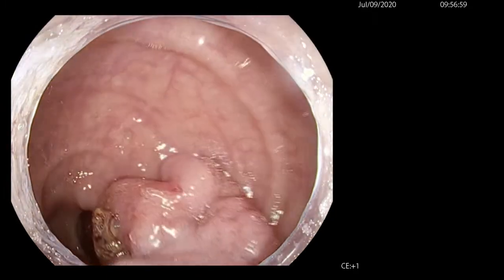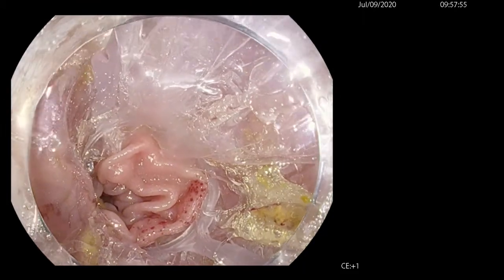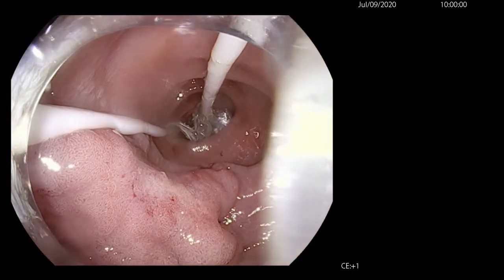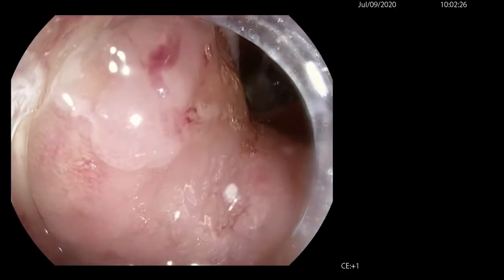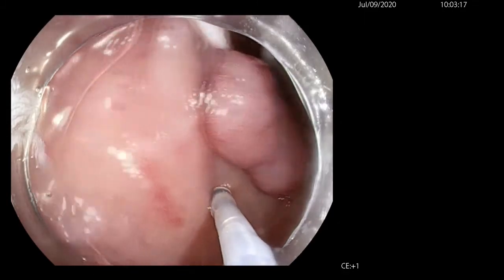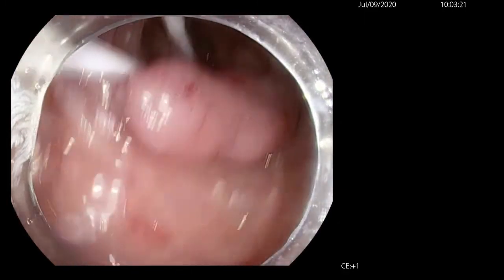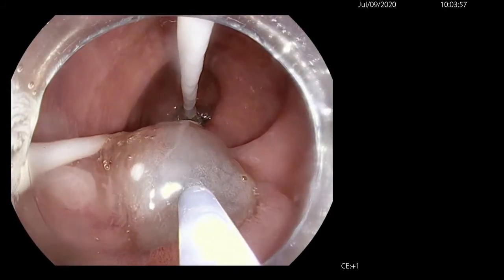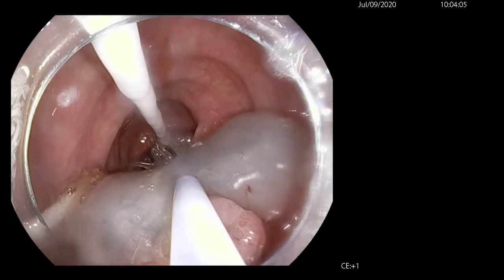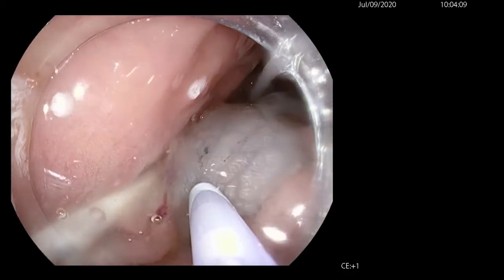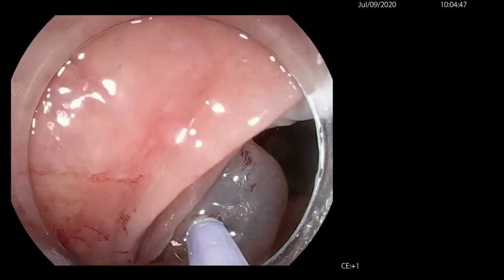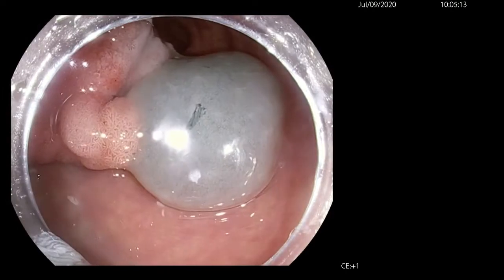After advancing the colonoscope along the device to the site of the lesion, the fore-balloon of the device was advanced to the oral side of the lesion to create the therapeutic zone. The polyp was then carefully examined and showed a tubular pattern with mild irregularities, but no sign of deep invasion such as loss of vascularity or distorted pit pattern. After careful examination, the lesion margins were marked using dual knife J with soft coagulation current effect 5 at 50 watts. The lesion margins were then lifted using a submucosal injection agent composed of 500 cc of Hespan, 1 cc of epinephrine, and 3 cc of methylene blue. It is important to ensure that all margins of the lesion are raised uniformly to avoid forming valleys between the injectates.